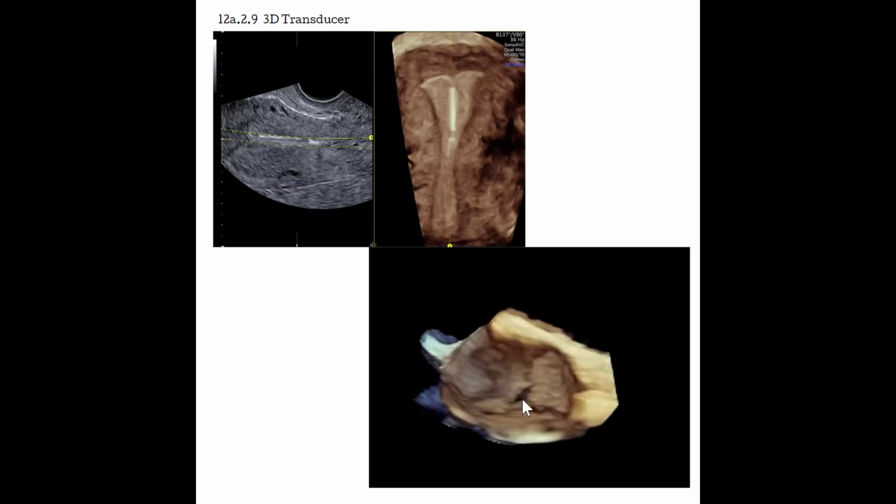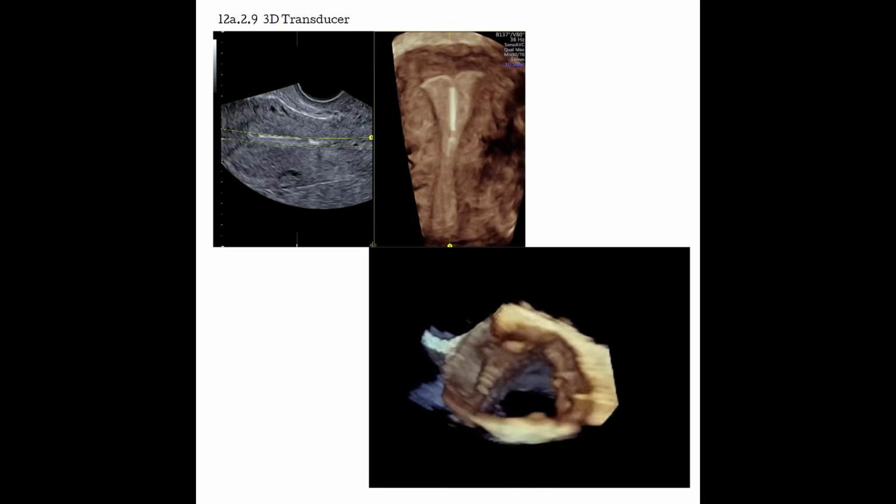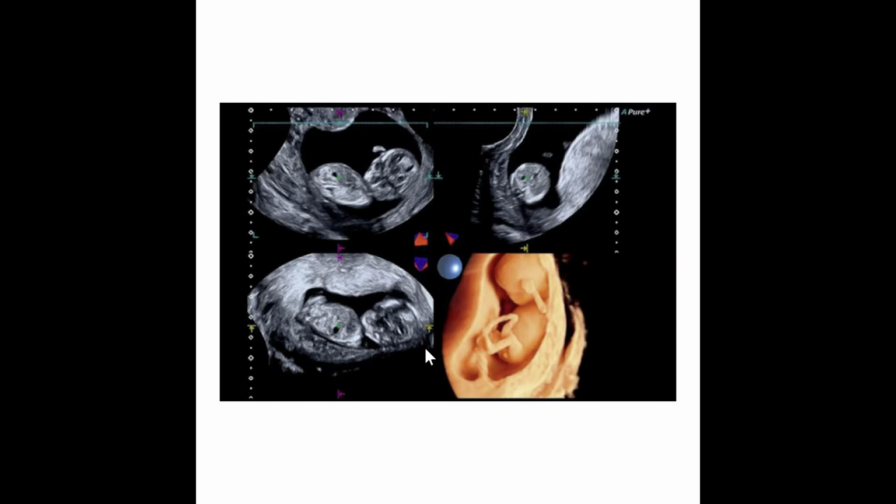The 3D part of it gives us a sense of depth to the picture, a sense of volume, and really just a sense of real-life imaging. This picture shows us how the machine can, again, make sense of all 3 of those planes. When you sweep through your anatomy, quite often you'll see all 3 planes. So here we have a lateral picture, side to side. This is our axial picture, up and down. And then this is our depth picture, front to back.